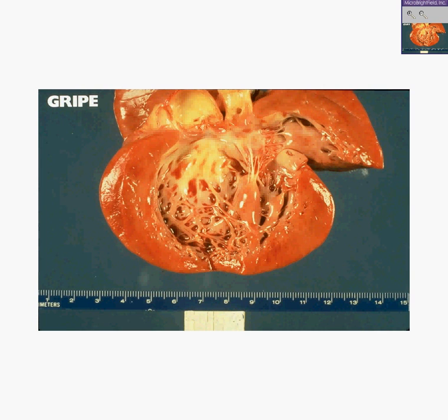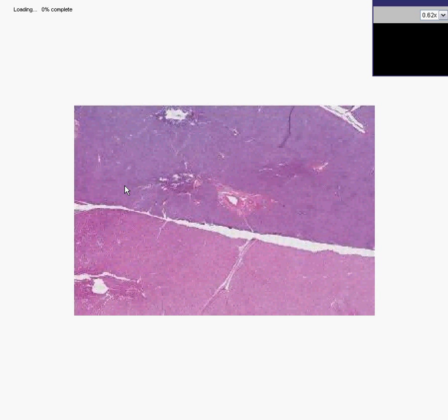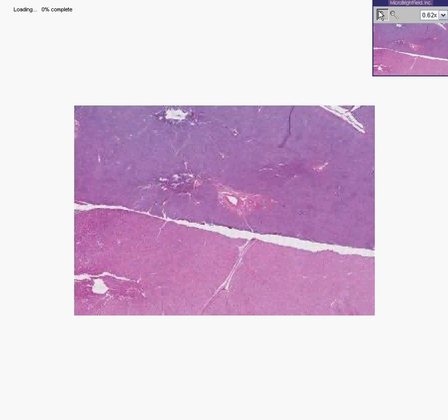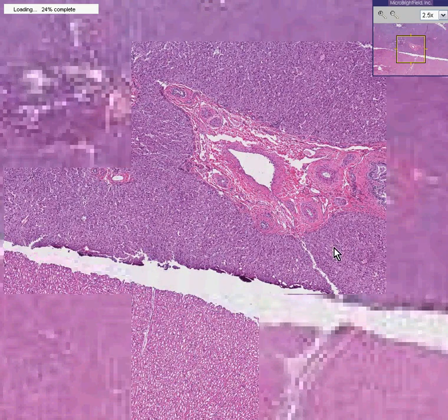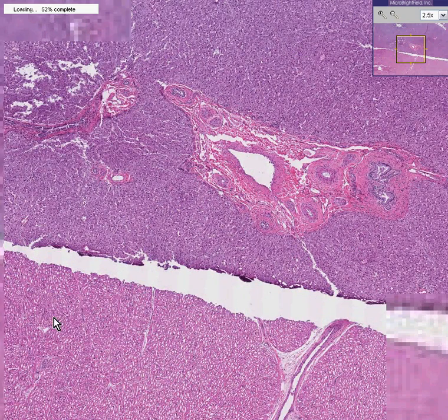Let's look at it microscopically — and in fact, let's look at the liver too. After a blank screen and then a black screen, we now have what I wanted to show you: we see a piece of liver on the top and a piece of heart on the bottom.